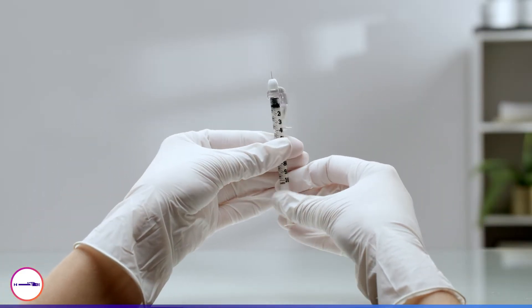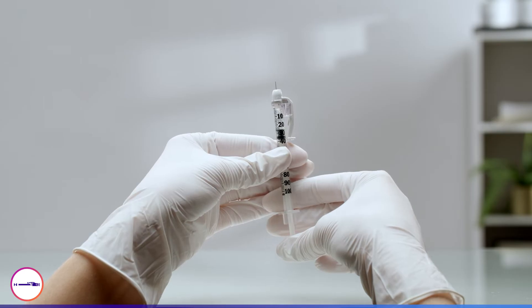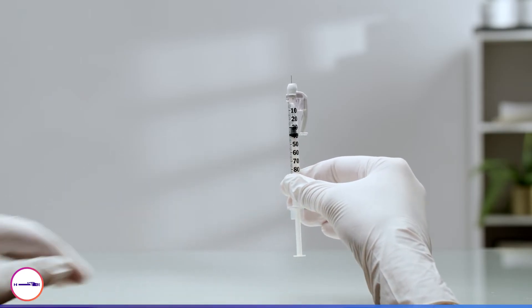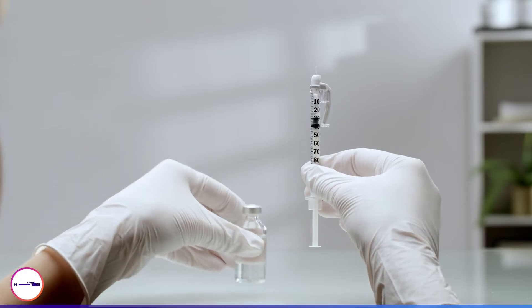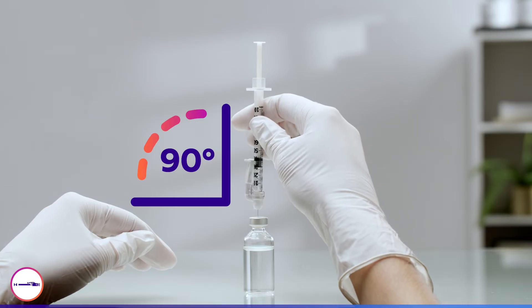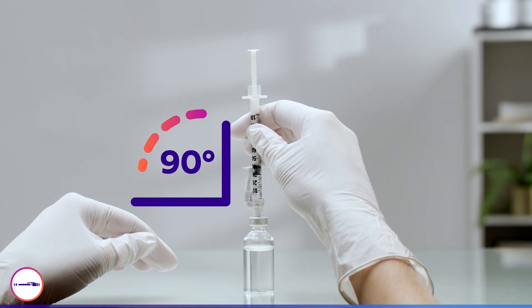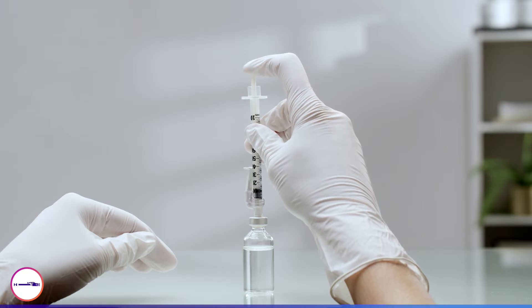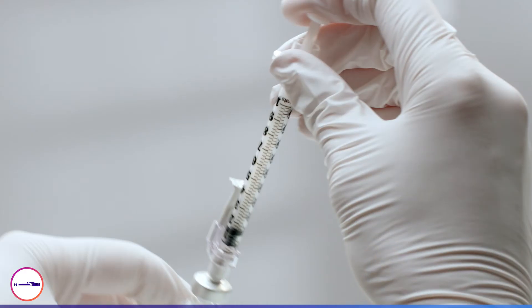Pull the insulin syringe plunger down to the desired number of units. You will need air in the syringe equal to the amount of insulin you will take out. Puncture the center of the vial at a 90 degree angle to avoid needle damage. Push the plunger down completely. Turn the needle and vial upside down.